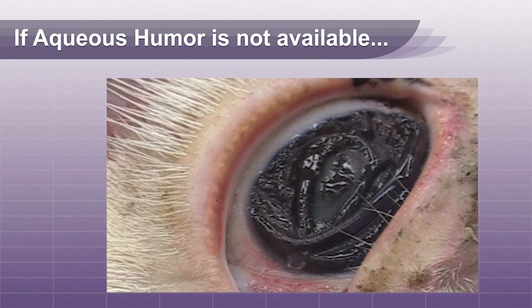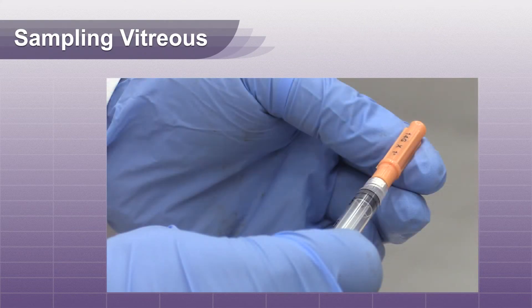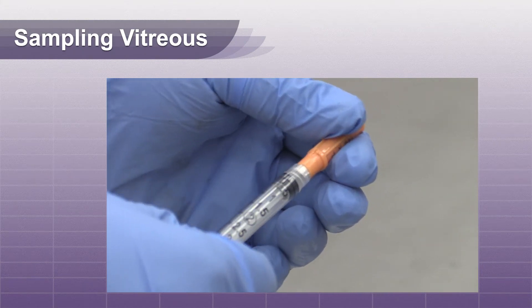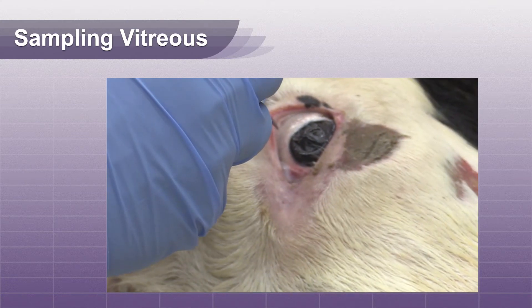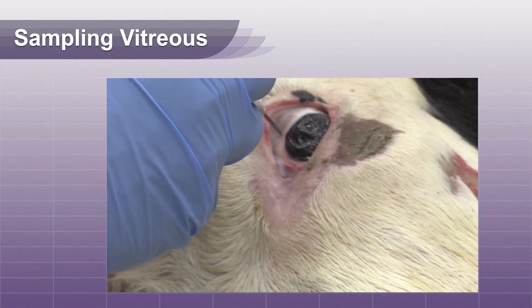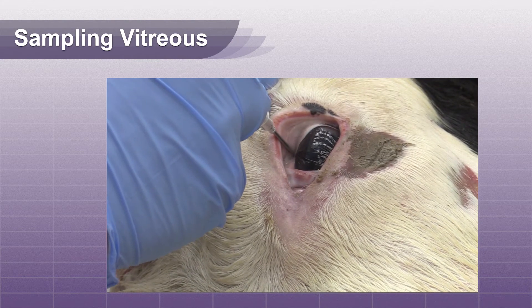If the bovine is dehydrated or aqueous fluid is not available for other reasons, you can sample the vitreous behind the lens. To sample the vitreous, use a 14-gauge 1-inch needle on a 3cc syringe. Insert the needle at the dorsal aspect of the eye while angling the needle behind the lens.